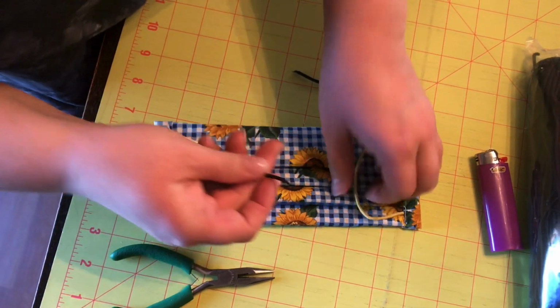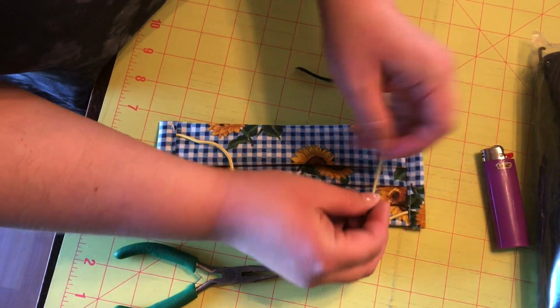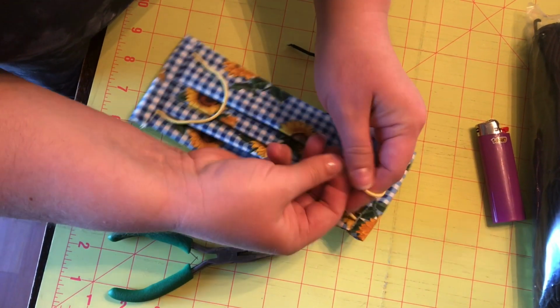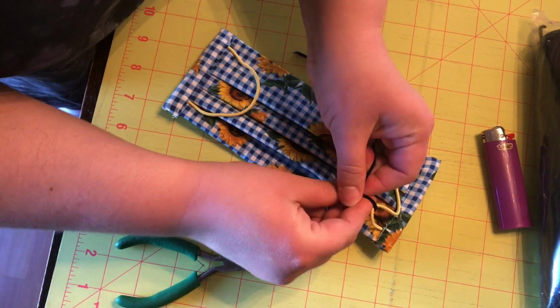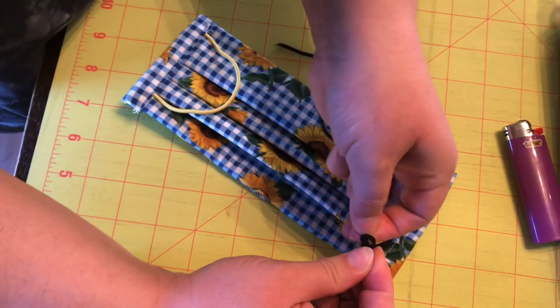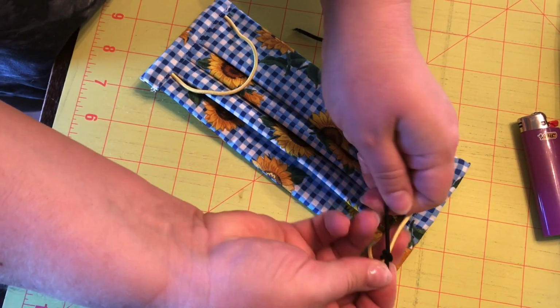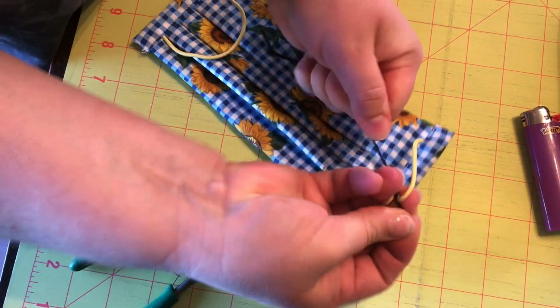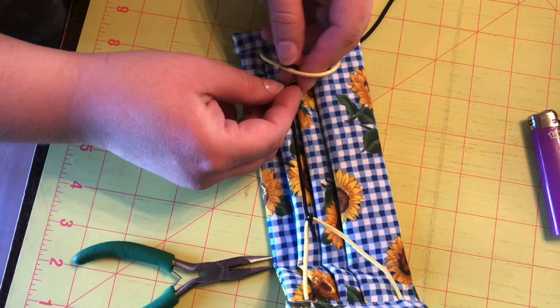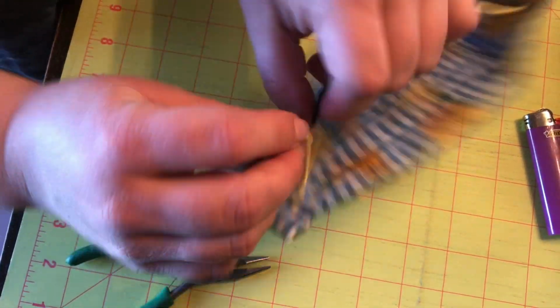Okay, I wanted to quickly show you how to add on these ties to help to relieve some pressure from your ear. You want to make a loop, come around, hold with one hand just a small amount of the elastic and push the rest of the elastic up to it. That way you have the most hanging off of the end as possible.